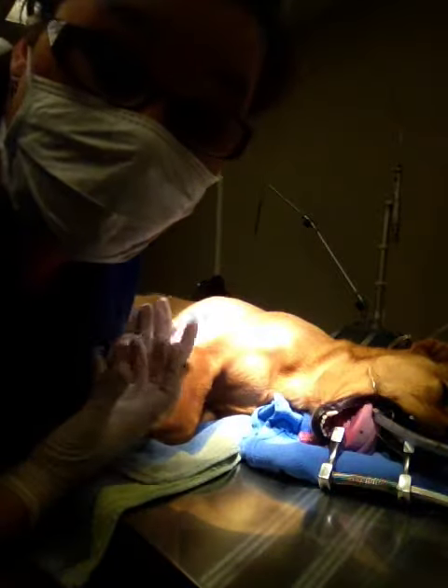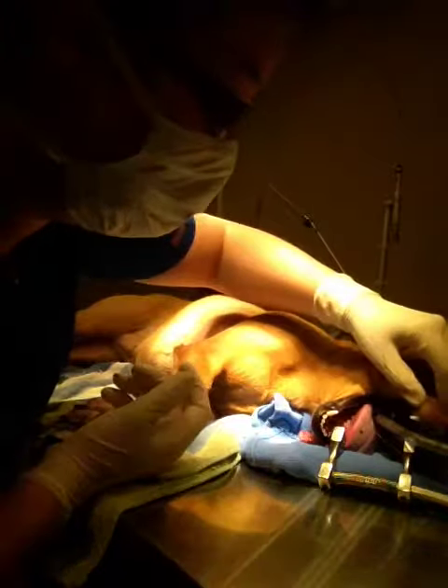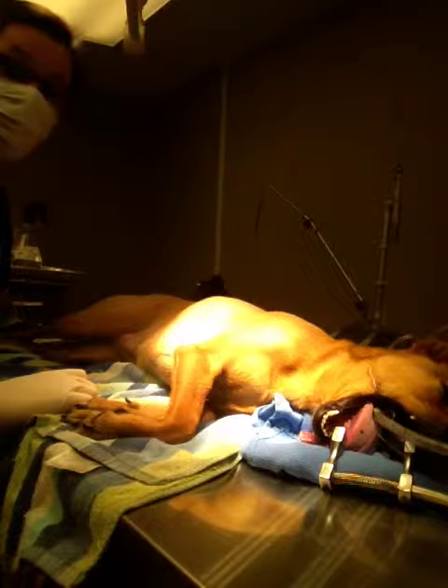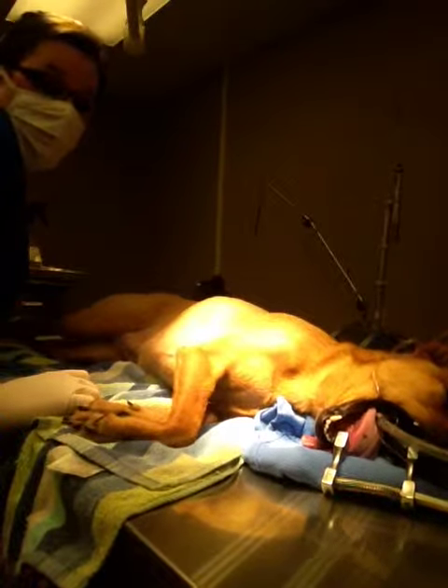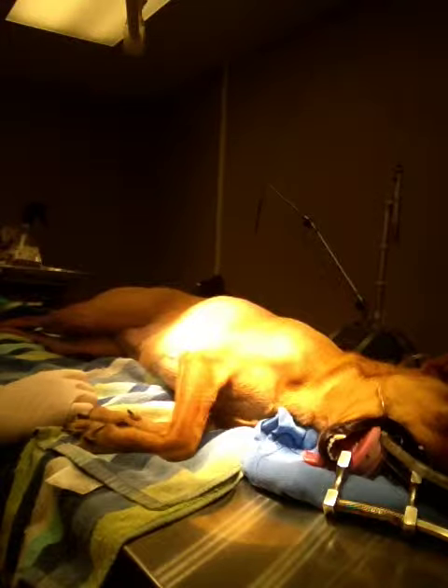Alright, after checking her tissues and noting everything in her chart, we are down to the cleaning part now. I'm going to tilt my table so that everything runs down and not towards her lungs.